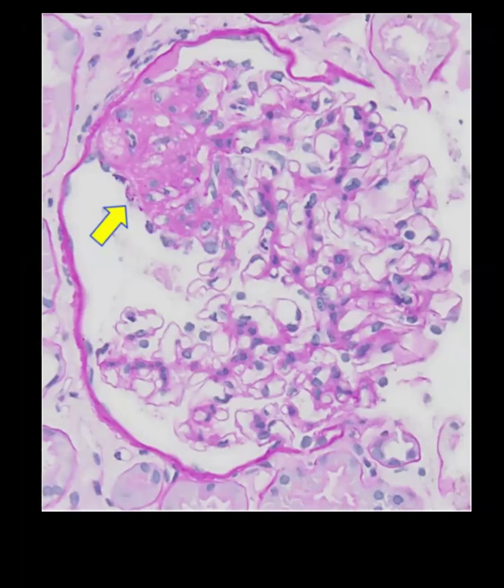Remember, when they give you a single glomerulus, always keep the terminology of segmental versus global. And when they give you 8 to 10 glomeruli, the terminology is either focal or diffuse. If less than 50% of glomeruli are involved, it is always a focal disease. And when more than 50% of glomeruli are involved, it is a diffuse disease.